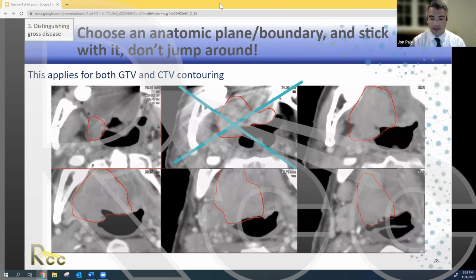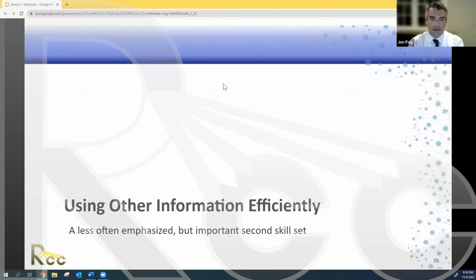If you were doing something in the upper GI, I think, yes, it would be much better to have IV contrast, even post-op, so that you could see vessels like the SMA or the celiac or things like that. So just by way of making some examples for IV contrast being helpful for certain sites, but not others. And if you have it, use it. Great question.